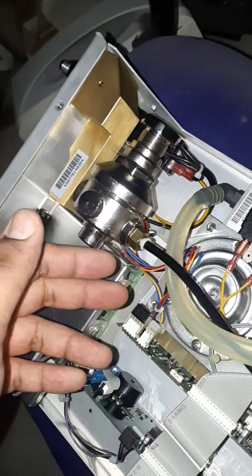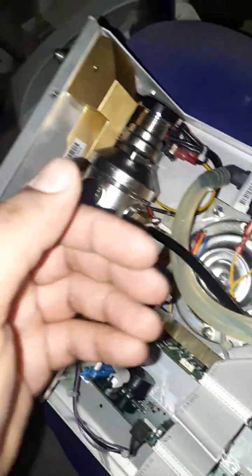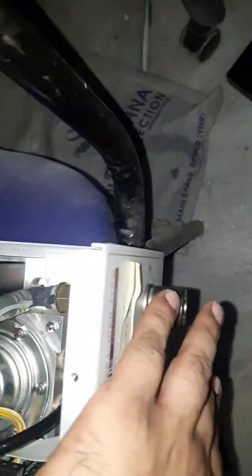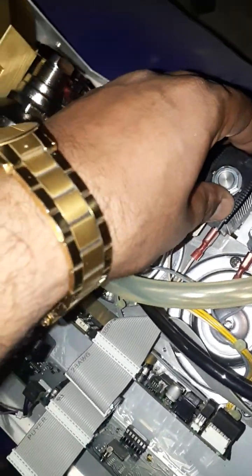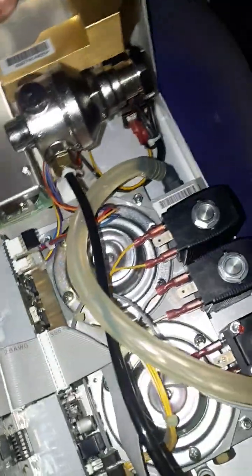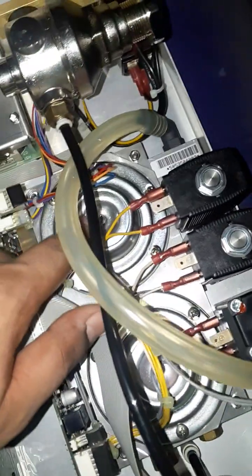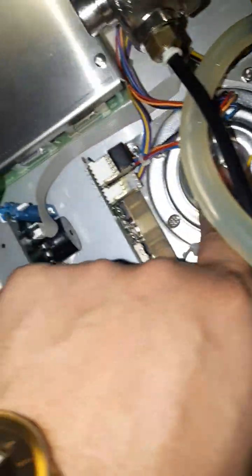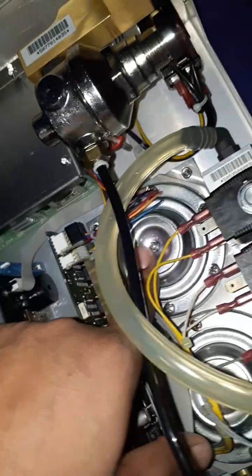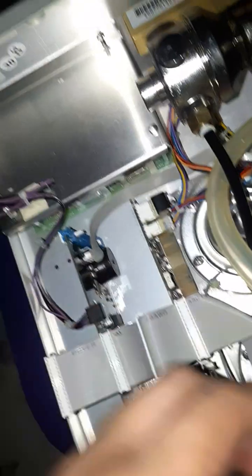If you increase this flow to a little bit high, you will get what? You will get a good output at the output end of this insuflator. Another thing, check whether your relays are working simultaneously or not. That is another option you have to check. After that, if everything is okay, then you have to open this chamber and check the seal here. And there are also 2 pressure control knobs here. You have to tighten them, or you can rotate them anti-clockwise or clockwise, by which you will get a different pressure range at the output.